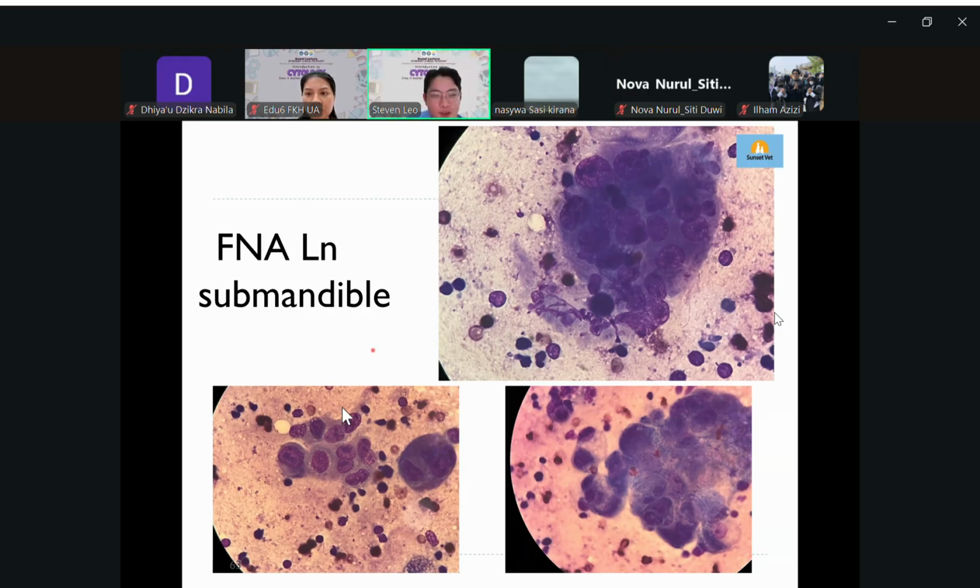Yes, because this is the epithelial one, so you can see it. Just remember, if it's only inflammation, you have to see the beautiful neutrophils. Is there any neutrophil or not? If you do not see a lot of neutrophils, just ignore it. It's only the naughty neutrophil, so just go to your place. But from all this picture, it's more to the cancer one.